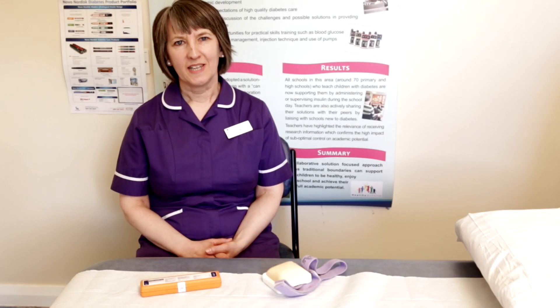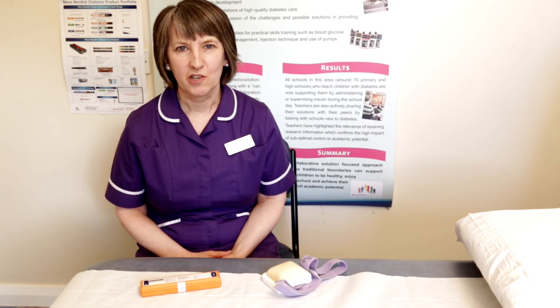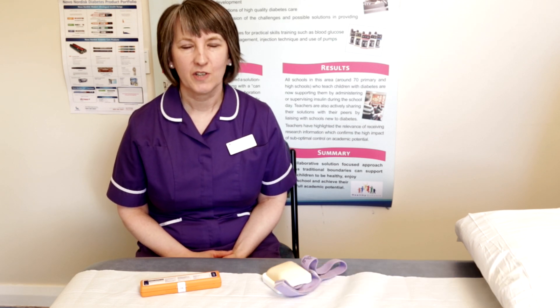Hello, my name is Wendy Sewell and I am Children's Diabetes Nurse Specialist and Team Leader here in Leeds. Today I'm going to show you how to give an injection of glucagon.